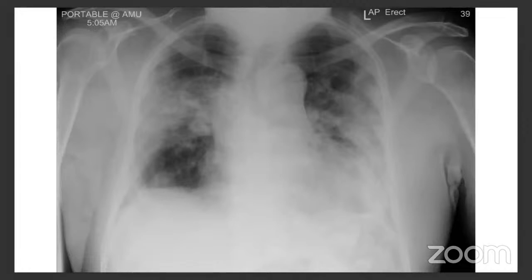You can see that now, bilaterally, there are peripheral opacities, affecting mainly the mid-zone on the right, with flattening of the diaphragm, and on the left side, which has become more confluent. There are some airspace shadowings as well. So by this time, because he was unwell, we put him onto high flow oxygen at a rate of about 75 liters per minute and 70%, which is as high as you normally would like to go.